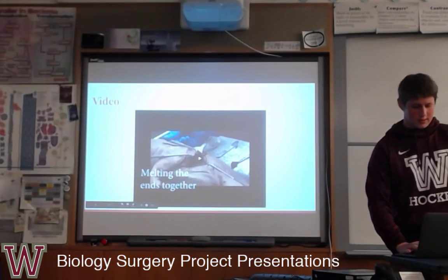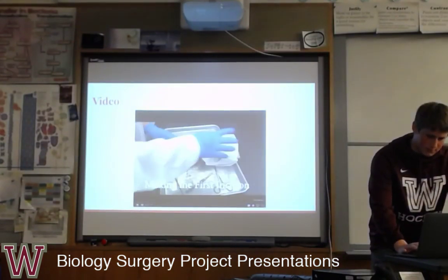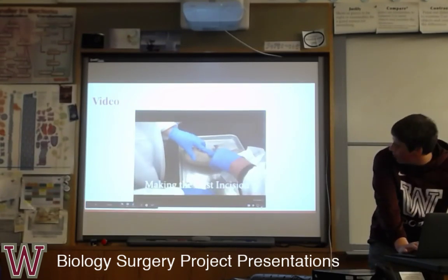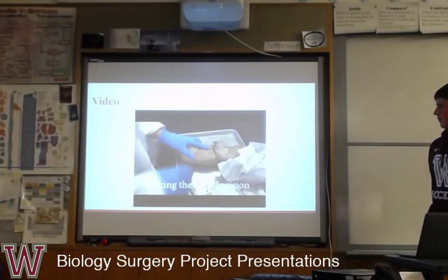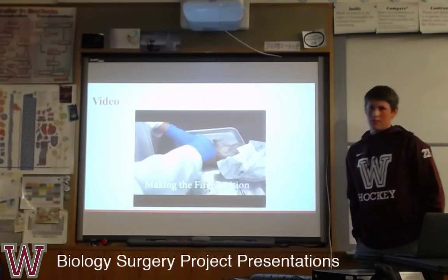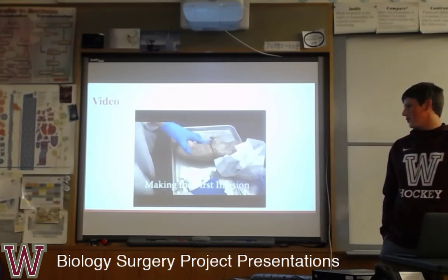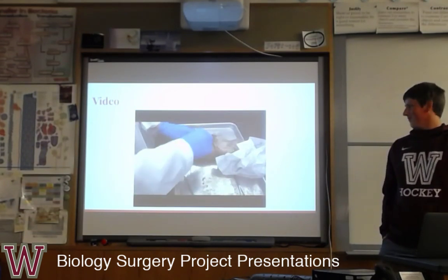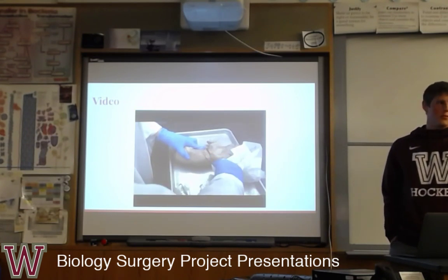This is our video of the procedure. Here we're just finding the correct area to make the incision. As you can see, we made a wrong incision to start the surgery. And then here we just had to cut a little deeper so that we were able to expose the ribs and the lung.